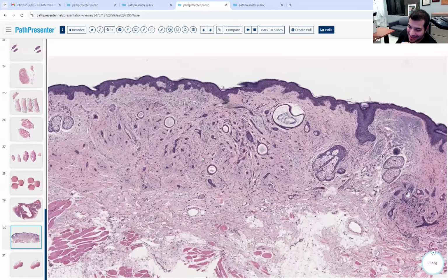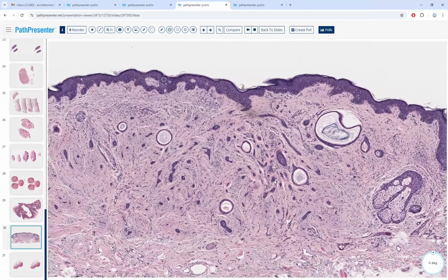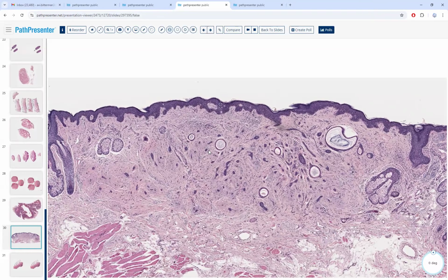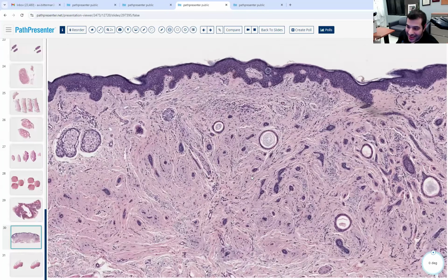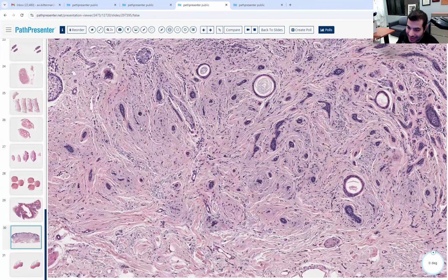Now, someone mention a differential that this might be in. Tadpole, paisley tadpole. What is your tadpole differential? Desmoplastic trichoepithelioma, okay. Morpheaform basal cell carcinoma, okay. MAC. Yep. Syringoma. Okay. So in this case, are we keratinizing? Yes. Okay, so there are cysts.